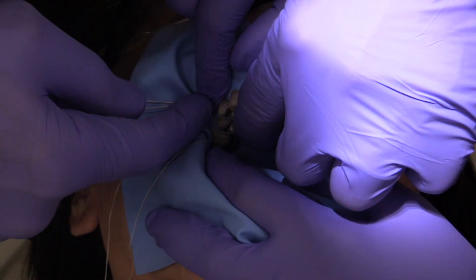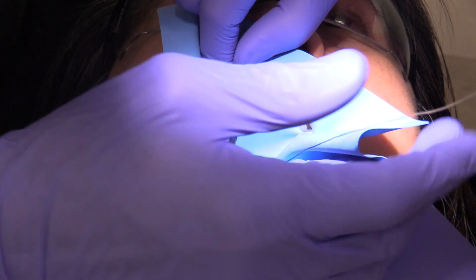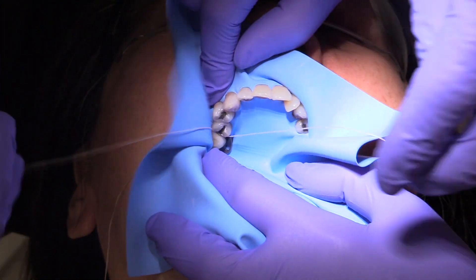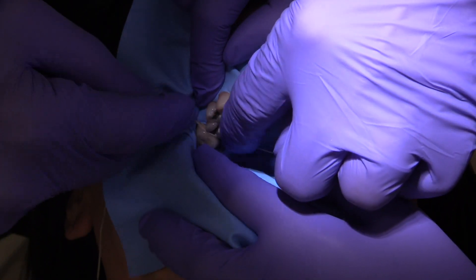And then without taking the floss out, just turn it over and put it through again. You notice you need a lot of assistance when you have tight contacts.